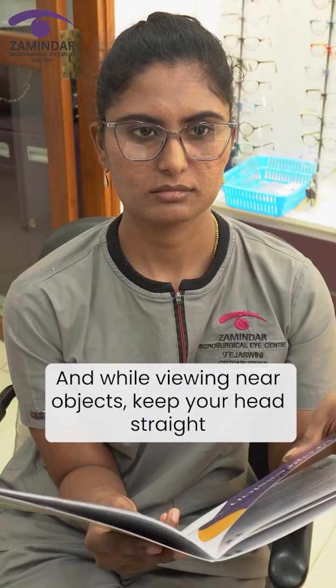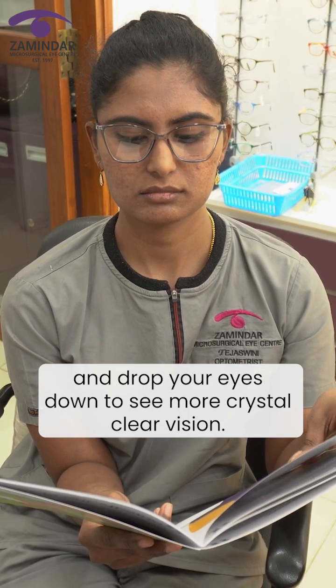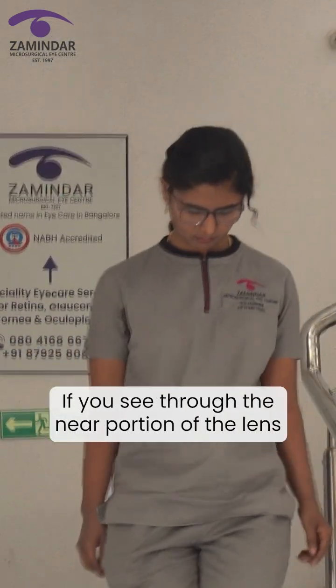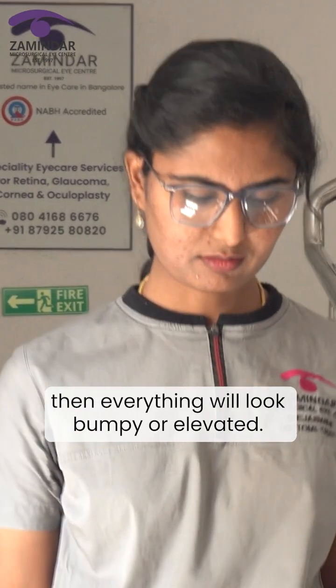While viewing near objects, keep your head straight and drop your eyes down to see more crystal clear vision. While ascending and descending from the staircase, the trick is to bend your head and see through the distance portion of the lens — if you see through the near portion, everything will look bumpy or elevated.